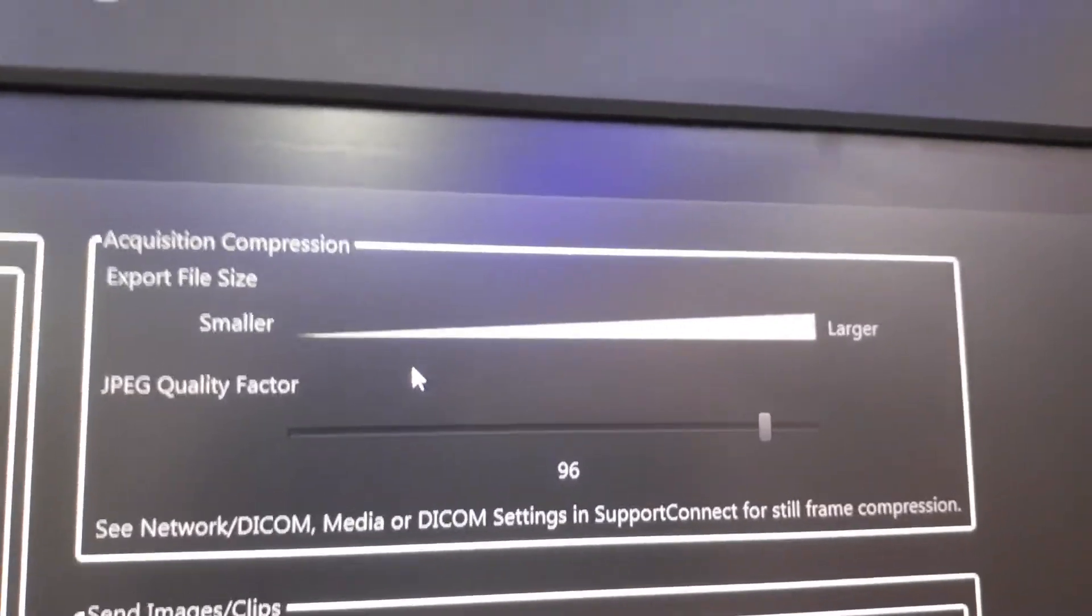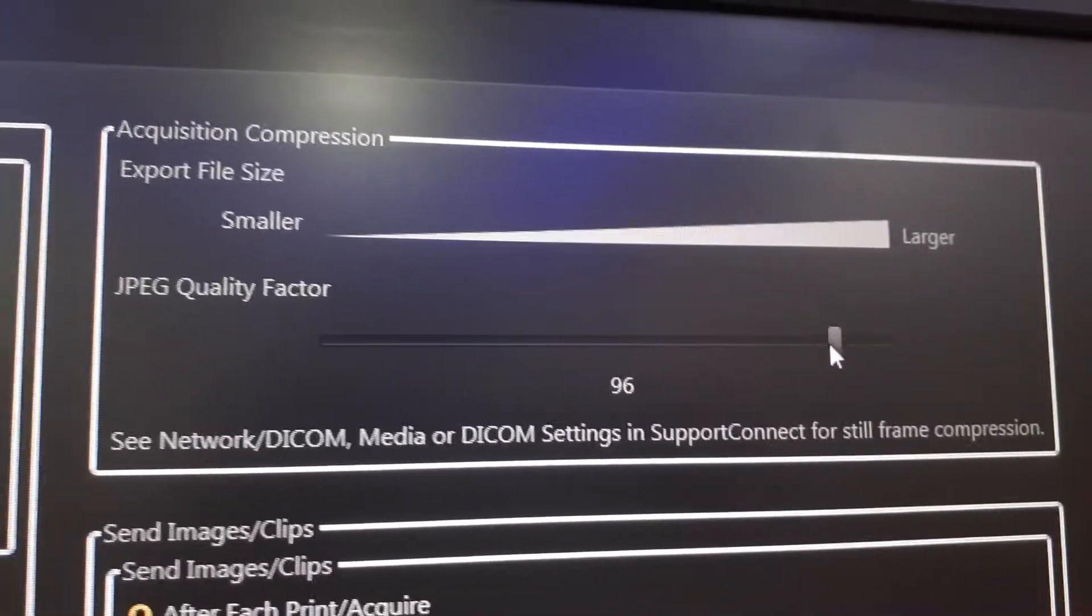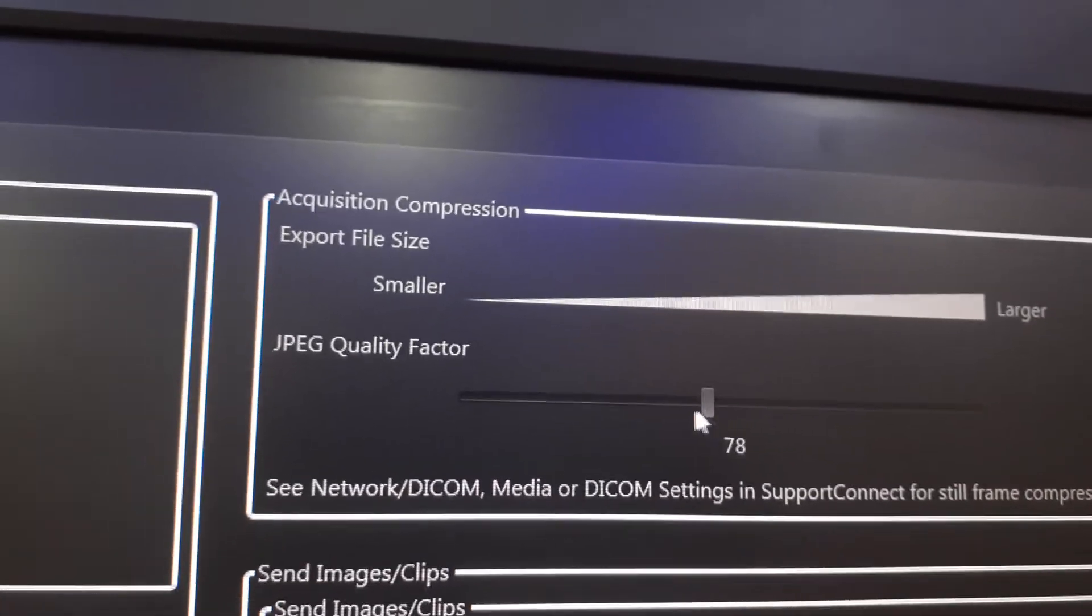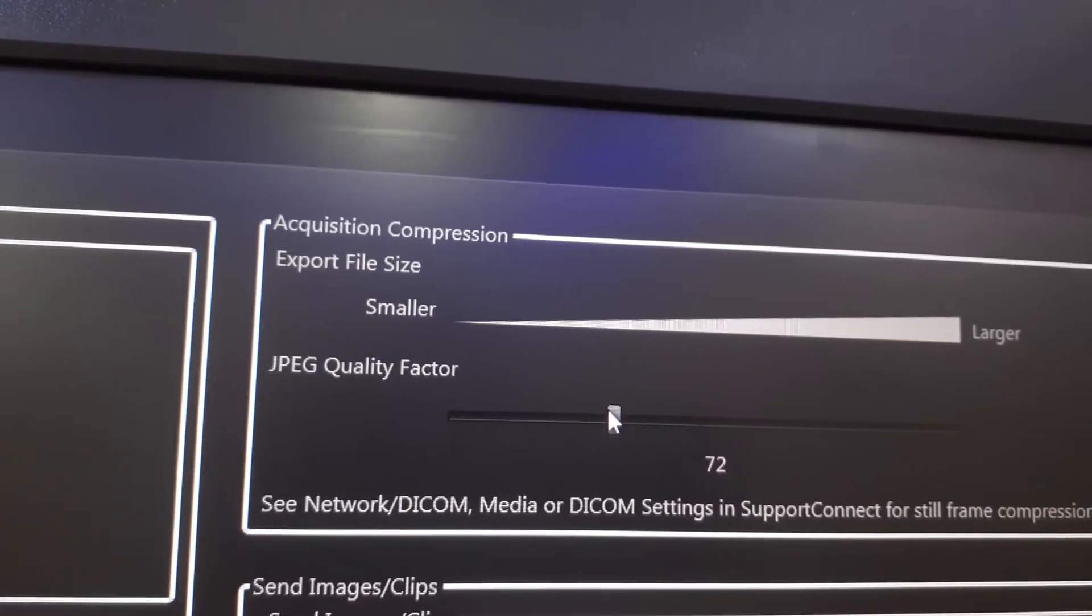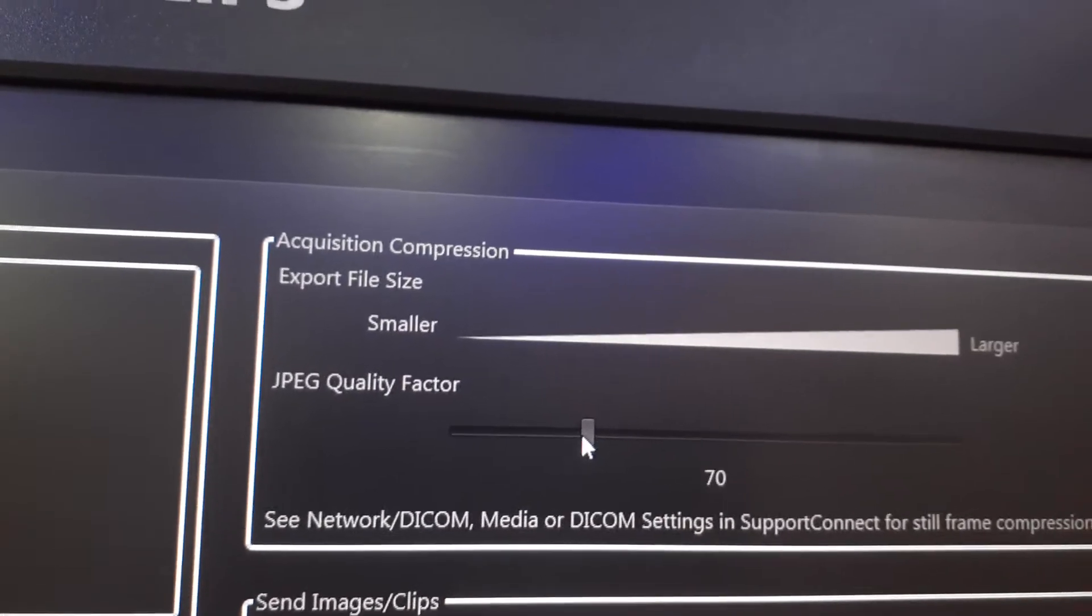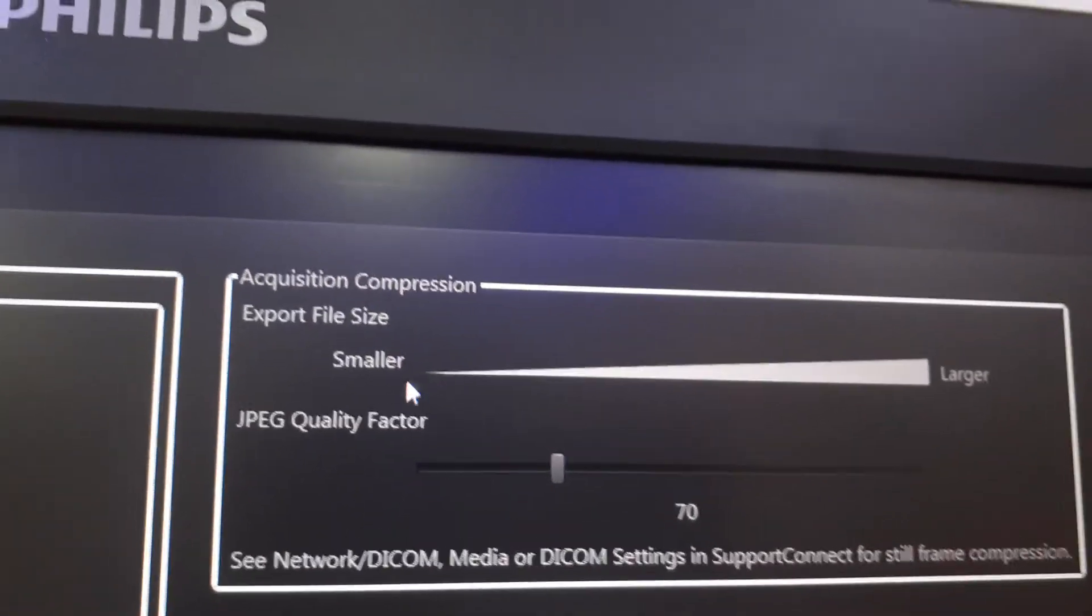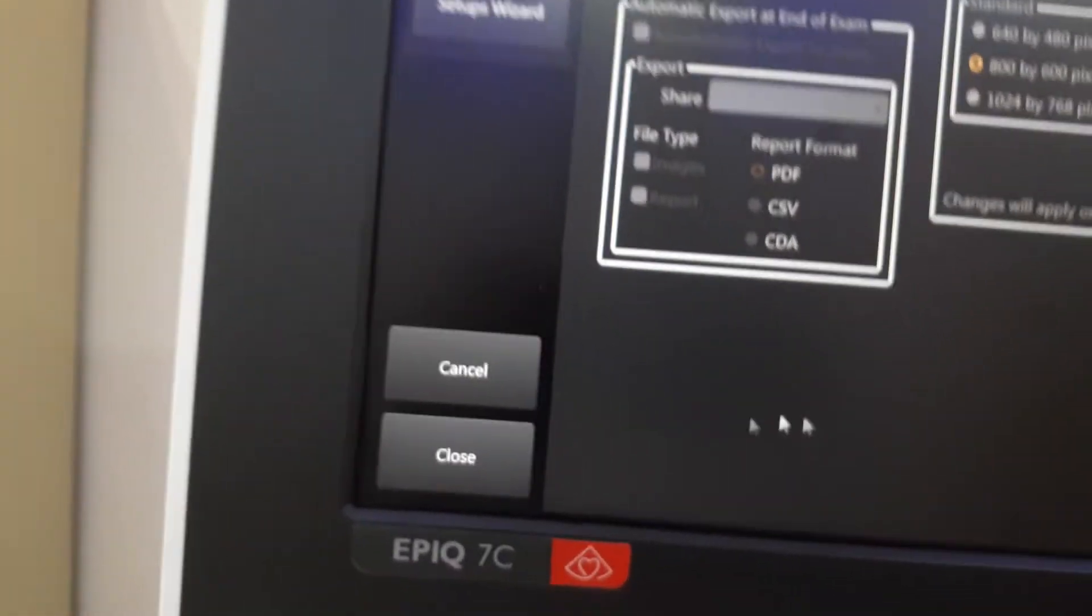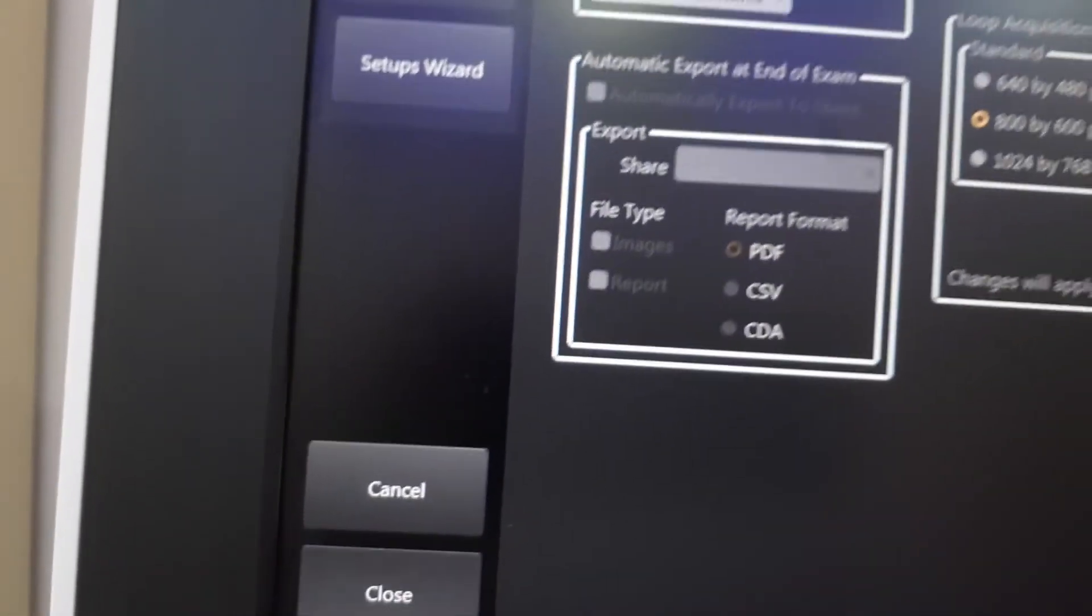We reduce that 96 number to around 70. That's a smaller size. Then just press close here.